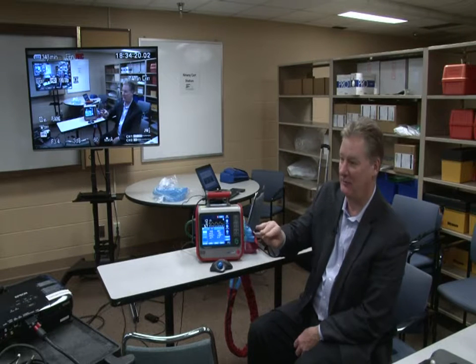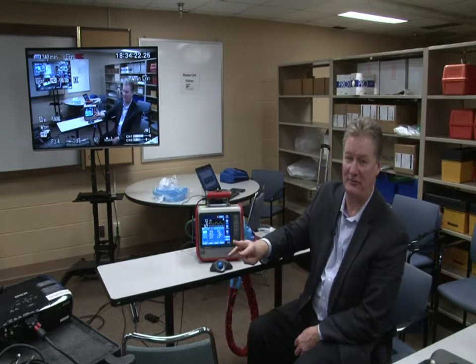Sooner or later, but it's not uncommon that clinicians, therapists, nurses, physicians, interpret or remember, maybe selectively, that lung protective ventilation strategy is 6 to 8 mLs per kilo. Well, that doesn't work especially in really obstructed patients, because they need a lot of time to exhale. So if you're using a low tidal volume and you have to have a minute volume, there's only 3 factors in there. It's rate, tidal volume, and minute volume. So if you move one and another one's constant, the other one has to change too. So if you turn the rate down, you've got to turn the tidal volume up.